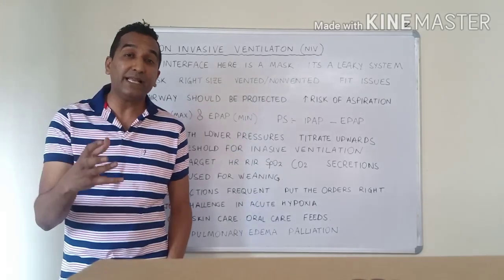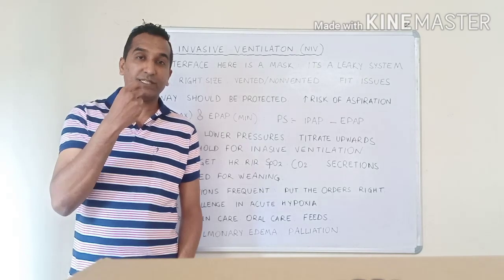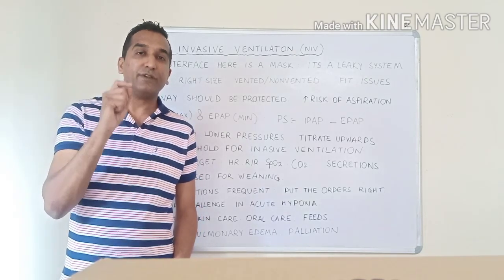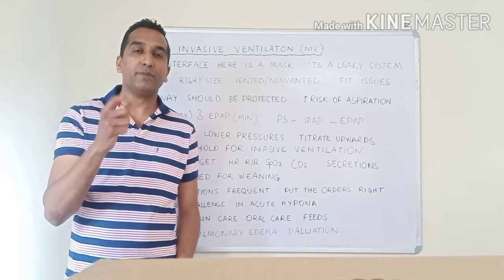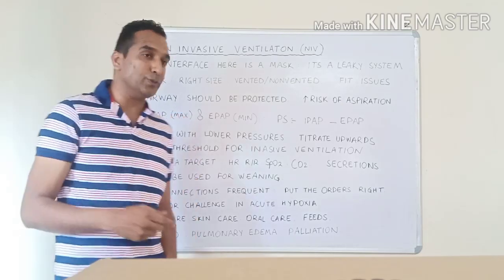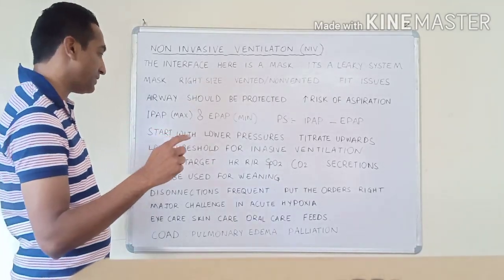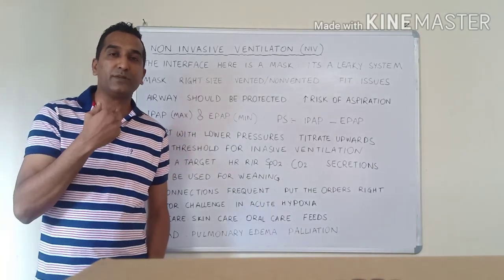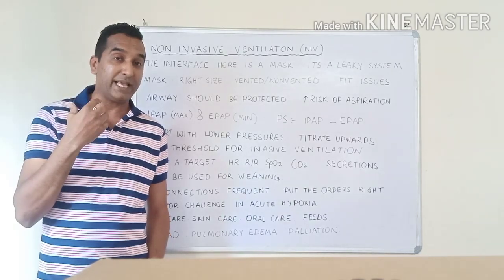And this choice is mainly because we can take the external airway out, which is the ET tube or the tracheostomy tube, because the major risk of infection in a mechanically ventilated patient is because of the bypass of the upper airways and the presence of a foreign object, which is a tube. The same thing should be kept in mind in an extubated patient, because the upper airways are bypassed when you intubate the patient or put in a tracheal tube. But as soon as you take them out, they also come into play.